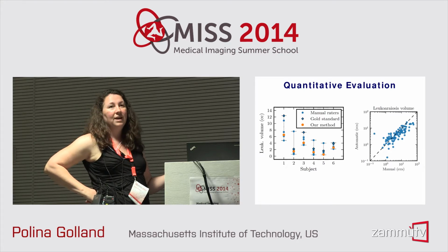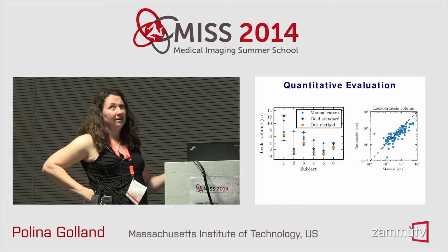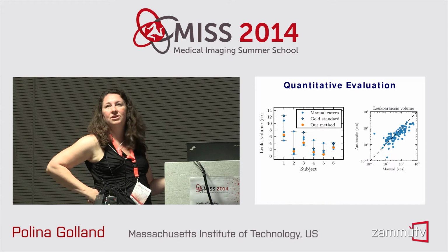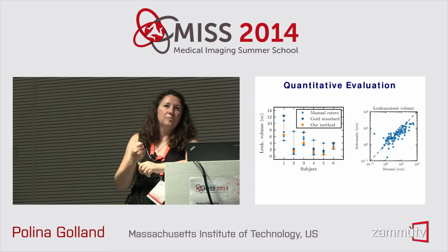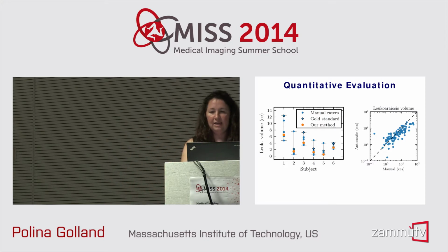We looked at them, and let's see. This one, I'll show you in a second, is where we misclassified the stroke for leukoaraiosis, so it's still a problem. And in this one, the registration failed. So we're working on methods to improve it, but what we're really working on is detecting when it is not good enough. It's another interesting direction of research: telling the humans when the algorithm failed.